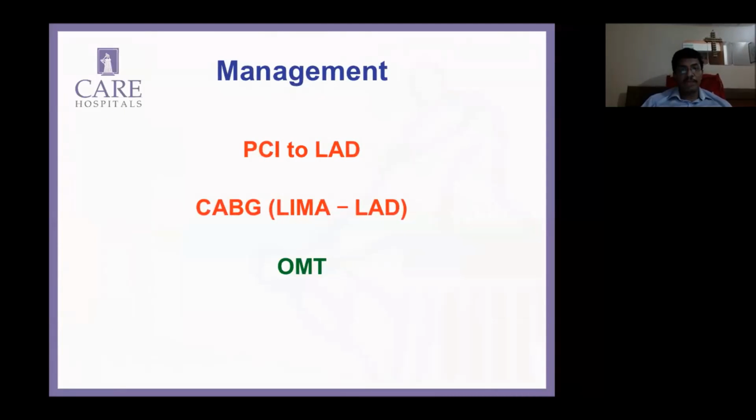So this particular patient, we did not subject her to PCI. We thought it was definitely too risky. We saw the stent. There was complete occlusion of that stent and absolutely no trace of the LAD. The surgeon obviously refused to go in because he could not see the LAD from any view. The CT also showed complete occlusion. So there's really nothing to graft. So she's been kept on optimal medical therapy and is currently doing well on follow-up with the usual diuretics, beta blockers, and ACE inhibitors. So Sharad, just want your opinion.